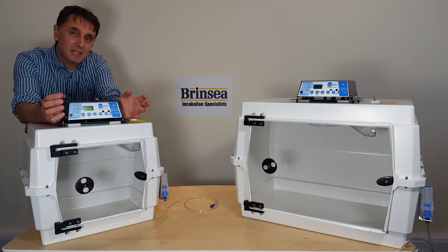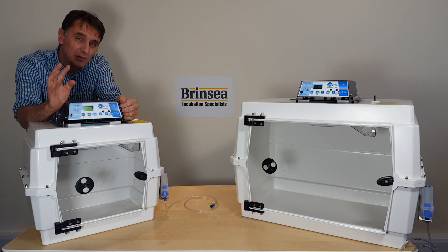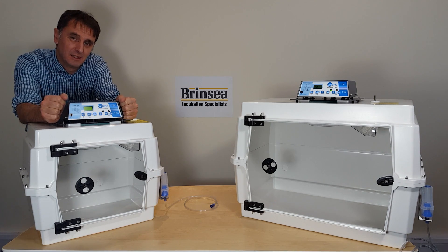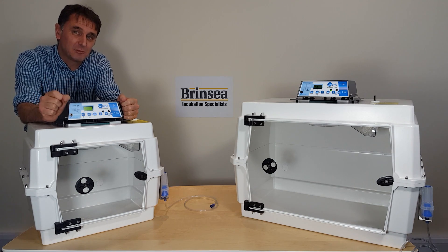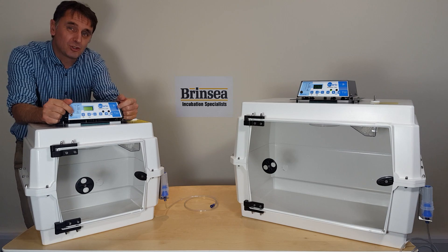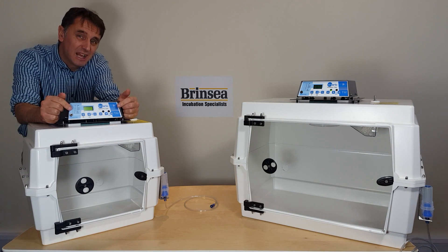This short video clip introduces you to Vetario, a thermal life support cabinet. As the name suggests, it's an intensive care unit for critically ill animals with fine temperature control and digital display of both temperature and humidity.